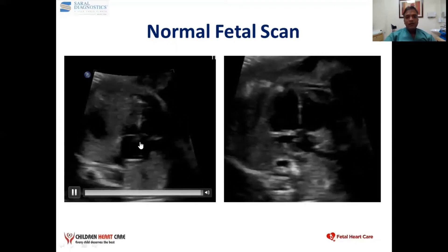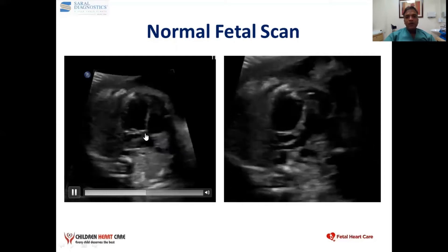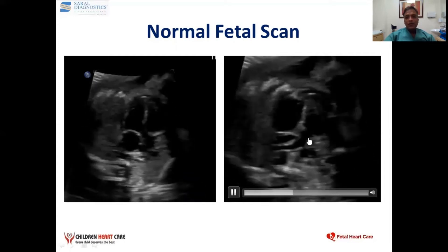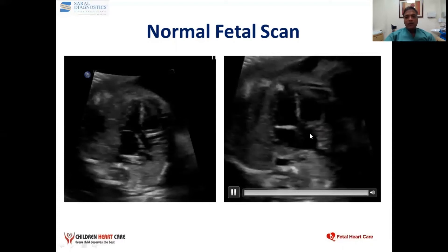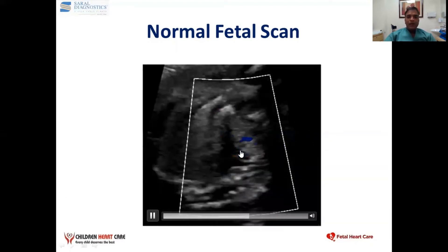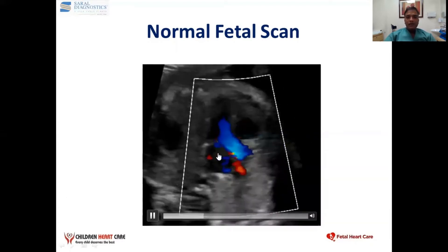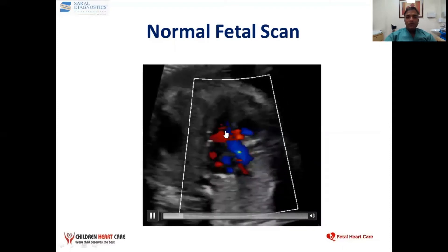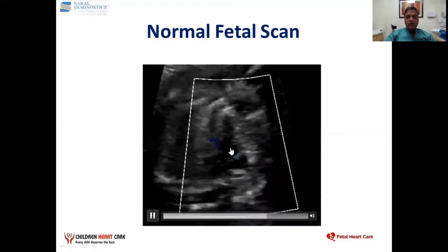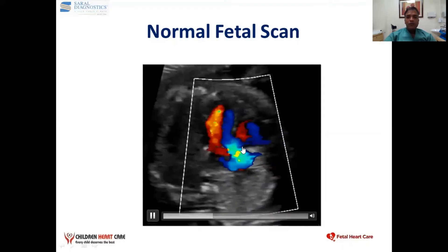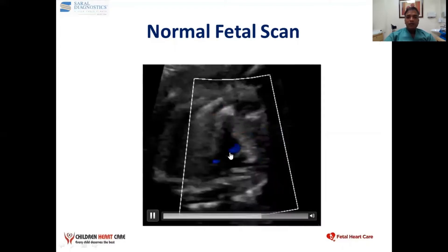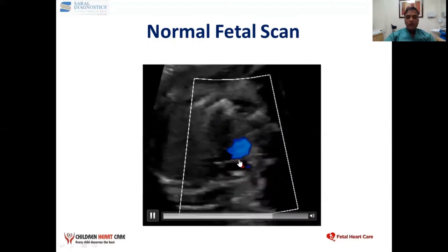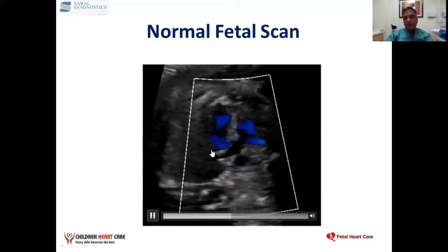There is an outflow from the left ventricle — this is the aorta. And from the right ventricle, another vessel that comes out is the pulmonary artery. As you can see in the color flow, the left atrium is going into the left ventricle with the red flow, and the outflow is in blue because the flow is away from the probe. This is the pulmonary artery. So the aorta and pulmonary artery are both crossing — one is going like this, another is going like this.